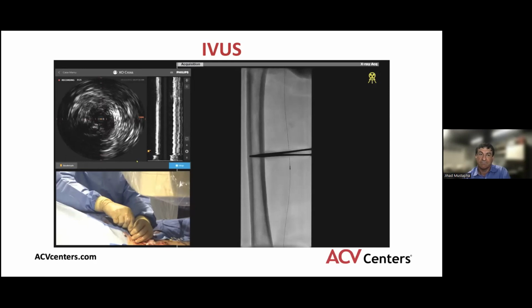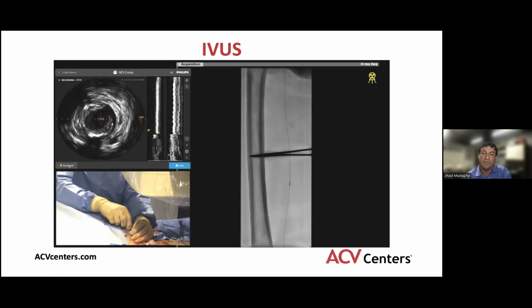Notice here the amount of unorganized ruptured plaque. This is an area waiting for disasters to happen, because the blood is going to come here and swirl. And if it does swirl, platelets may get activated, thrombi may form, and embolization can happen. So this cannot be left alone. Something should be done to it.